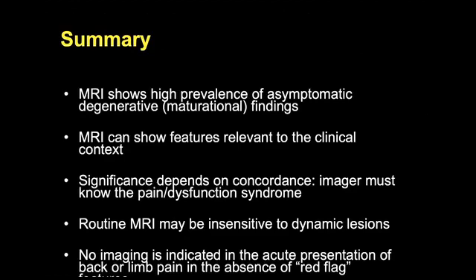So in summary, MRI can show a high prevalence of non-symptomatic degenerative, so-called maturational findings. We get wrinkles in our skin, we get wrinkles in our discs. MRI can show features relevant to the clinical context. Again, characterizing what the pain pattern is and imaging patients that are symptomatic, not using MRI as a screening exam. The significance depends on the concordance.